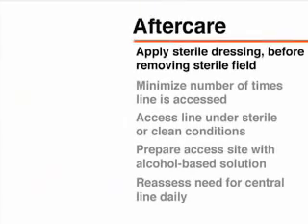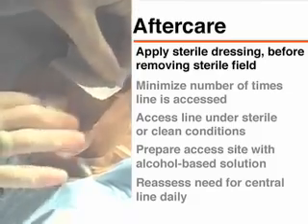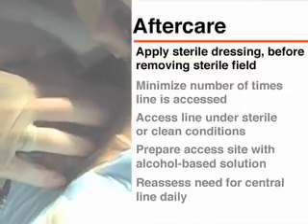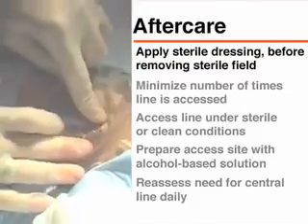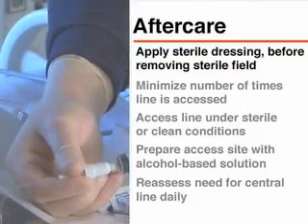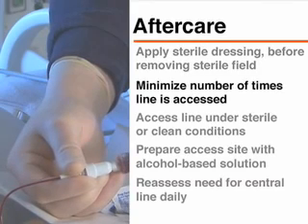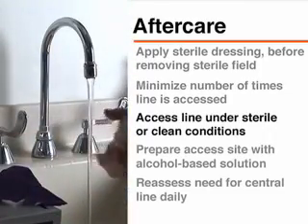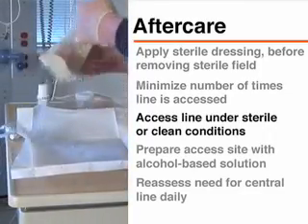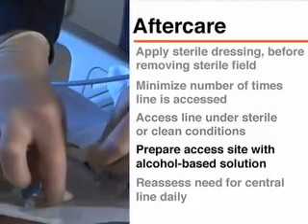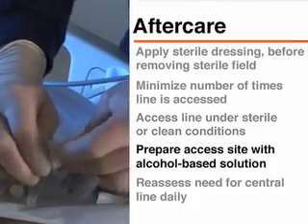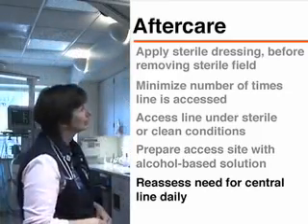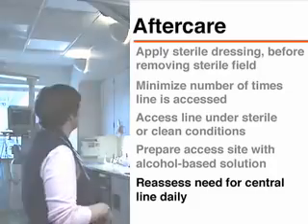A sterile dressing should be placed on the insertion site. The dressing should be changed daily and whenever blood or liquid accumulates or it loses its seal. In order to minimize the potential for infection in the central venous line, the following precautions should be observed: the number of times the line is accessed should be kept to a minimum; each time the line is accessed, this should be done under either sterile or clean conditions; the access site should be prepared with an alcohol-based solution; and there should be a daily assessment to determine whether the central line is still needed, so that it can be removed as soon as it is no longer necessary.